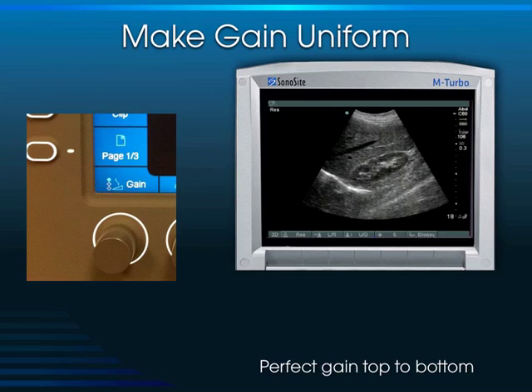So this is a hepatic vein coursing through the liver. It's anechoic. It also doesn't have any walls to it. It's got very thin walls, which you don't see on ultrasound. We just see a black line running through the liver. And this very hyperechoic structure, anybody know what that is? That's the diaphragm. I hear people whispering. Very good. There's the diaphragm right there.